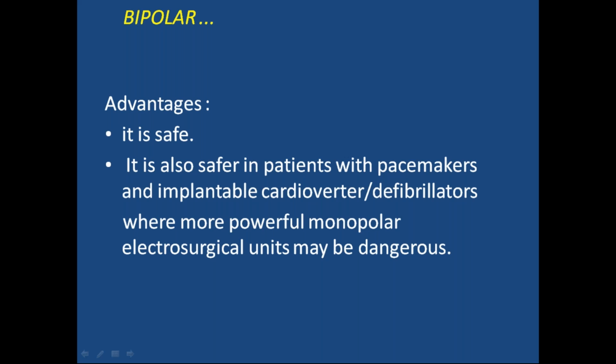Generally, electrosurgical devices are contraindicated in patients who have cardiac pacemakers or implantable defibrillators, because the current which passes across the body traverses into the pacemaker, causing a different waveform pattern and different current impulses released from the cardiac pacemaker, causing the heart to change out of its pattern of heartbeat.